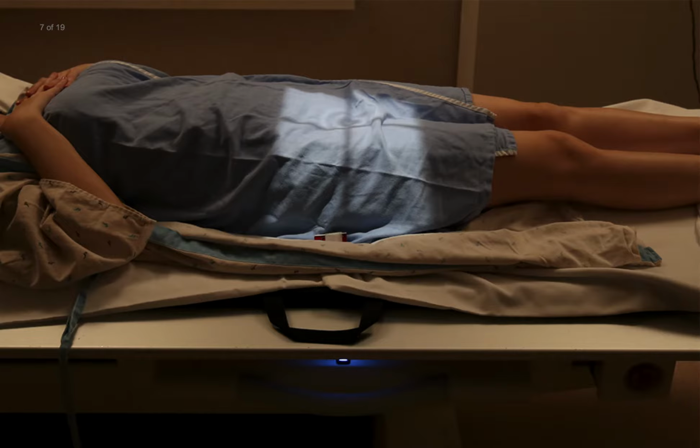If a patient has an implanted orthopedic device, adjust the image receptor size and central ray position to include the device in its entirety. Anatomical markers are placed on the image receptor to identify the anatomical side that is being examined. The patient's gonads are shielded, and the shield is placed between the X-ray source and the patient. The patient should be instructed to hold very still, and the exposure is made on a suspended breath.